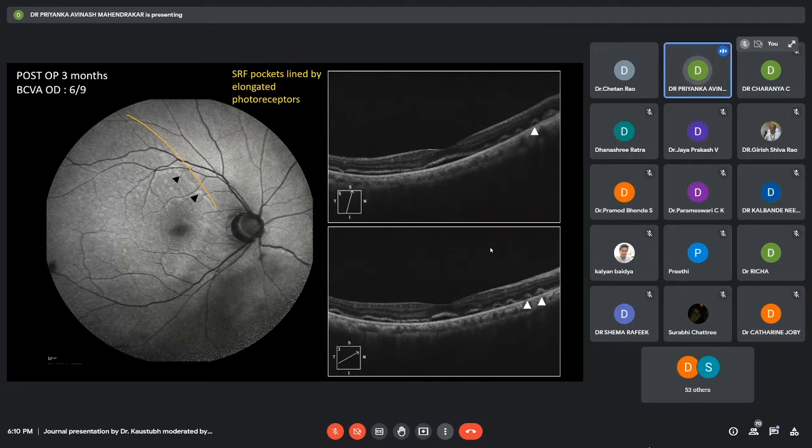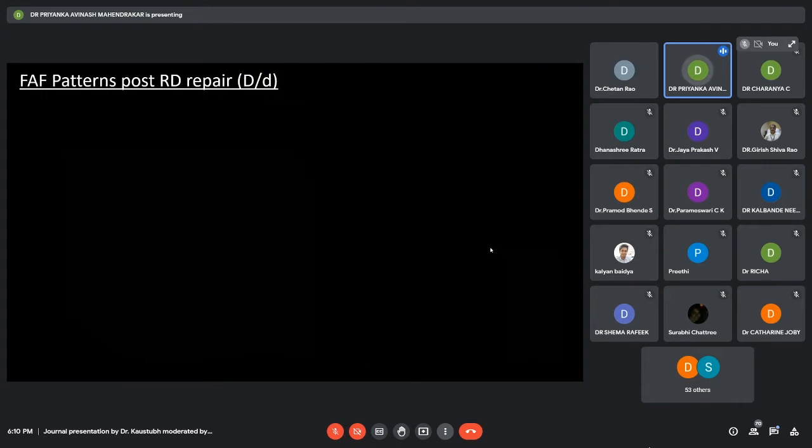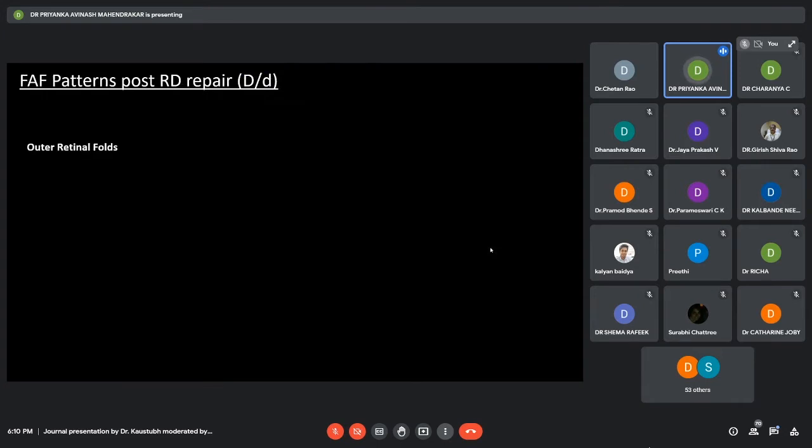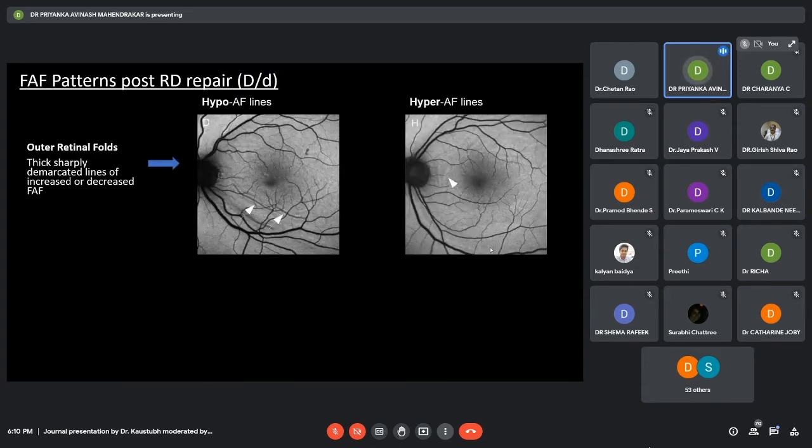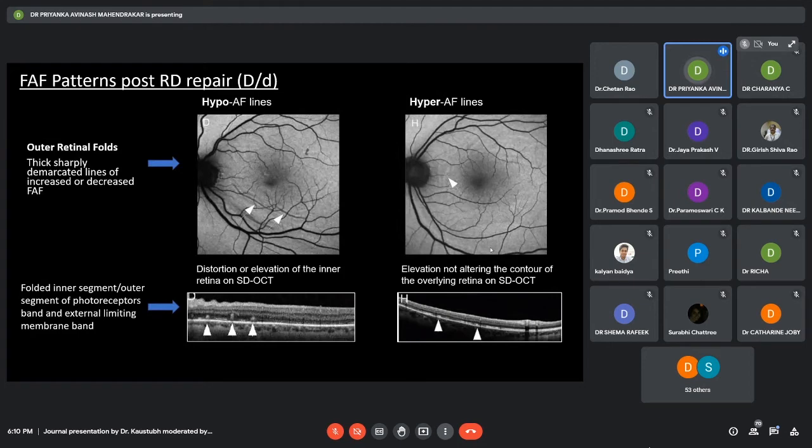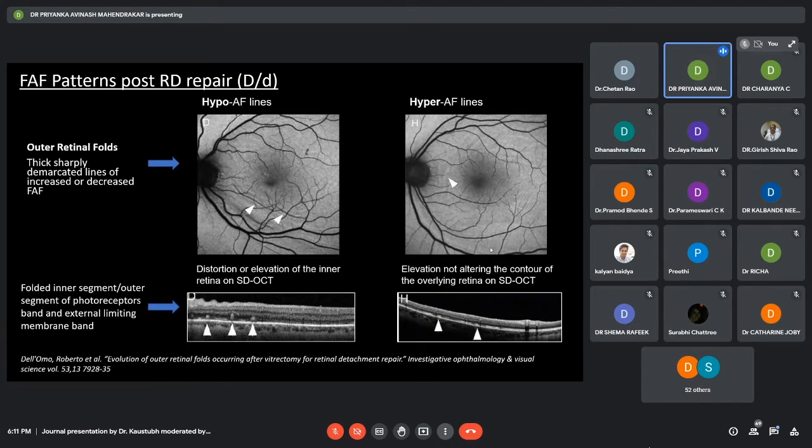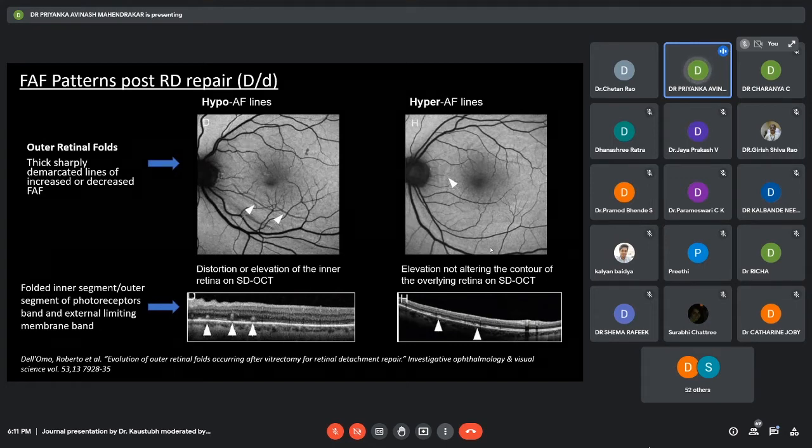Now, the differentials for autofluorescence patterns seen post-retinal detachment repair: the first one are the outer retinal folds. These can be hypo or hyper-autofluorescent lines seen after retinal detachment repair. Correlated on OCT, they are basically folded inner segment outer segment of the photoreceptor band and the external limiting membrane. These are initially hypo-autofluorescent. Later, they turn into hyper-autofluorescent lines and later they resolve in due course of time.